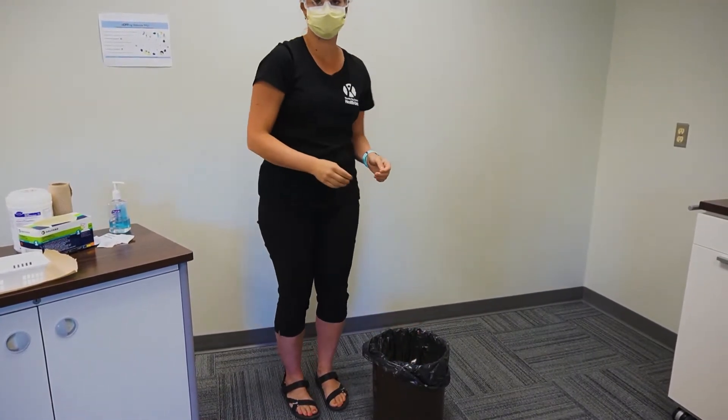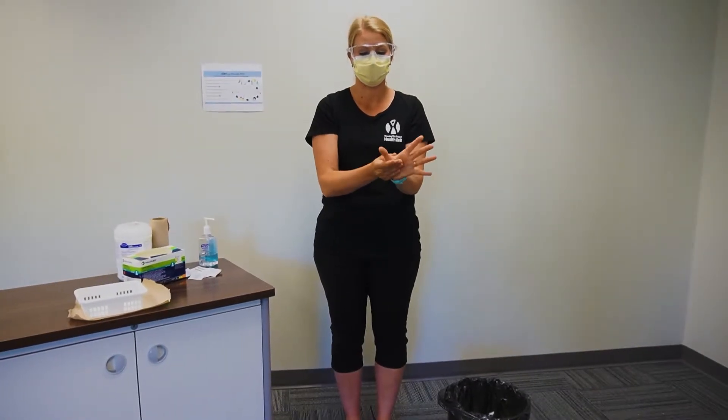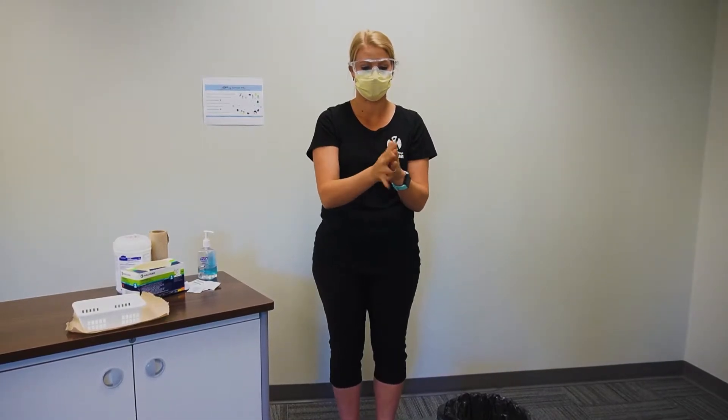Perform hand hygiene. Your hands were contaminated while removing gloves and gown. Hand hygiene is important as you are now going to be touching your face.